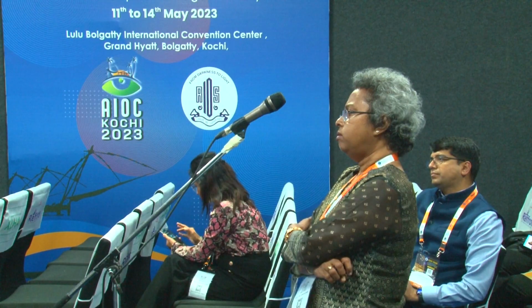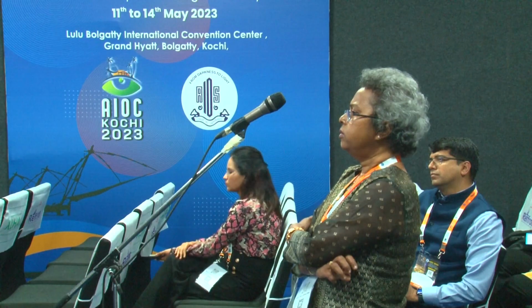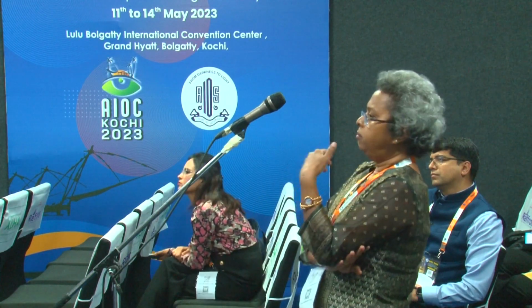So you just have to, and that is purely Descemet's membrane. Majority of the times it will be Descemet's membrane along with the Dua's layer, which is a little different, and that is going to be a little taut also. So here we have to create a compression effect rather than a pushing effect with the air and gases.